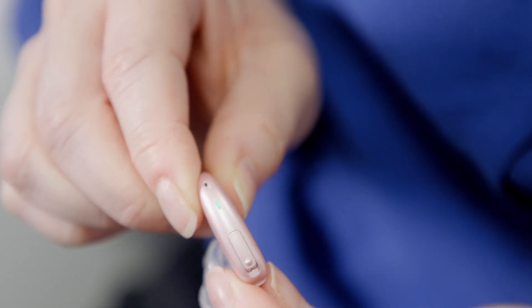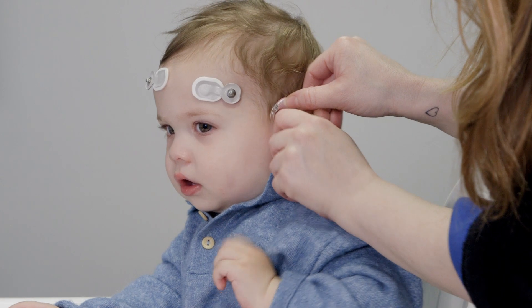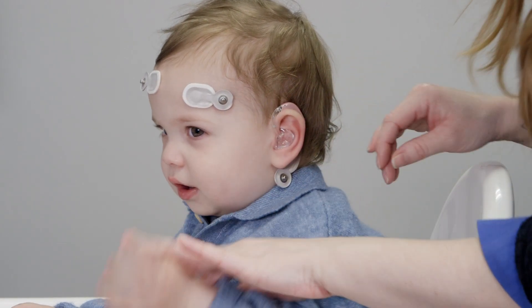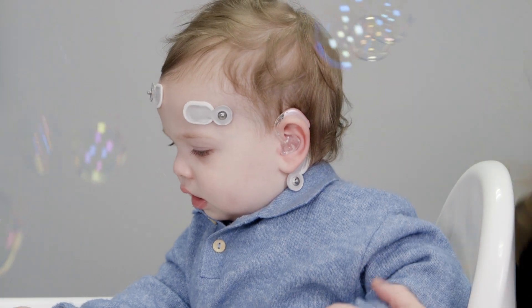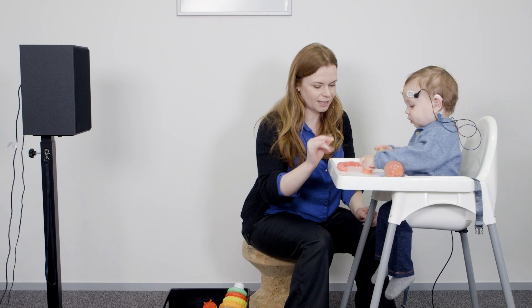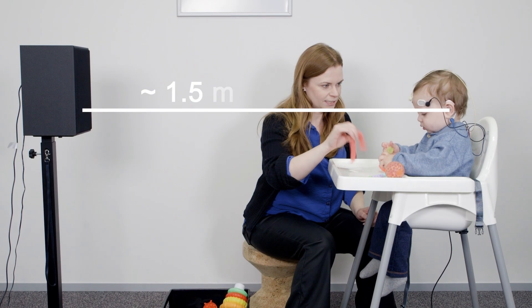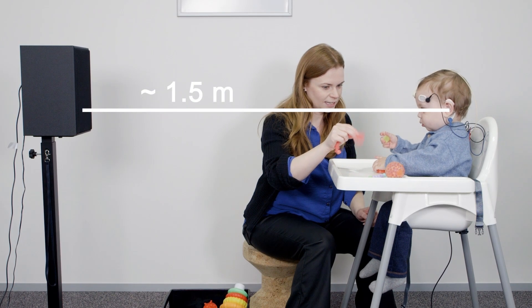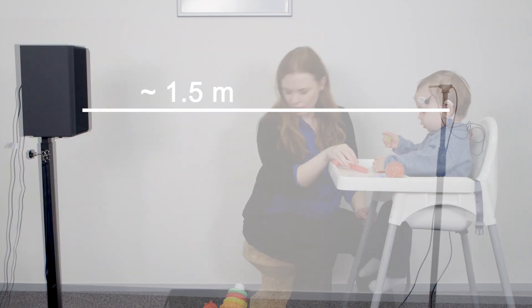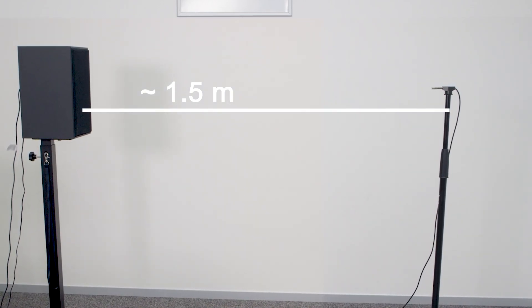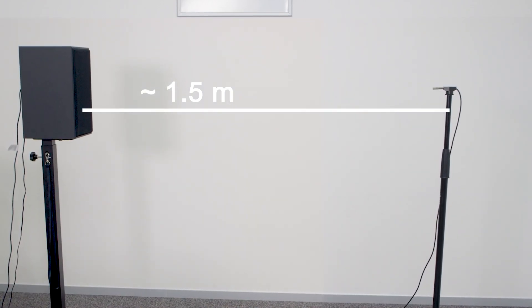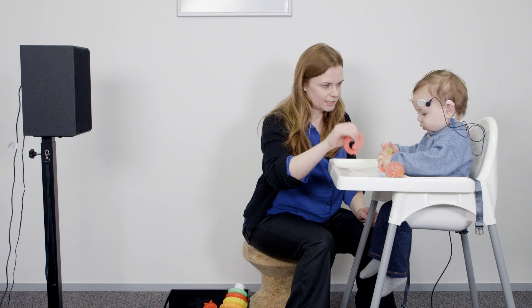For aided cortical testing, it's important to ensure that the patient's hearing devices are working, switched on, and worn correctly. The child should be seated comfortably 1.5 meters away from the freefield speaker in the same place used for the initial calibration. They can be seated alone or on their adult's lap.